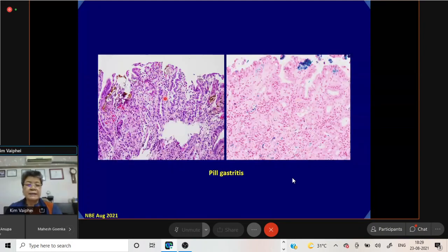And now there is something called pill gastritis, which we do come across quite frequently, so one has to be aware of this particular condition. The commonest medicine which can produce this condition is iron tablets. Here one could see, along with the erosions, edema, inflammation, and fragmentation of the glands, that it is very friable. So there is a gap. This is an artifact because of the friability during handling, cutting, and staining.